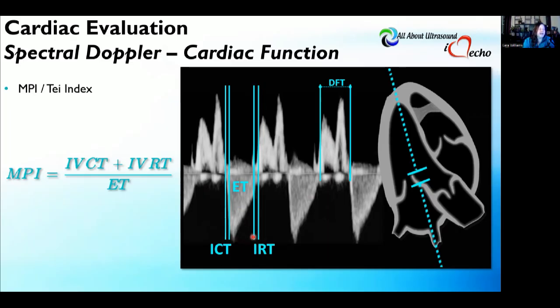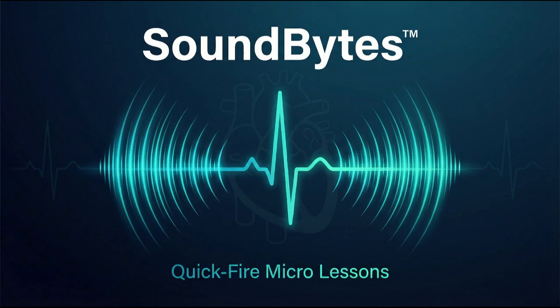So we're back into diastole after the ejection time is over, before the E wave, so this is that start of diastole. And then we have diastolic filling time. So diastolic filling time is the time that the ventricle is actually filling with blood. And so that's how you would break that down when you look at the aortic valve.